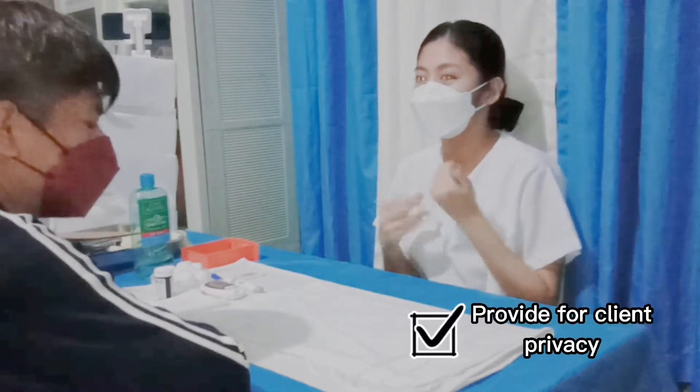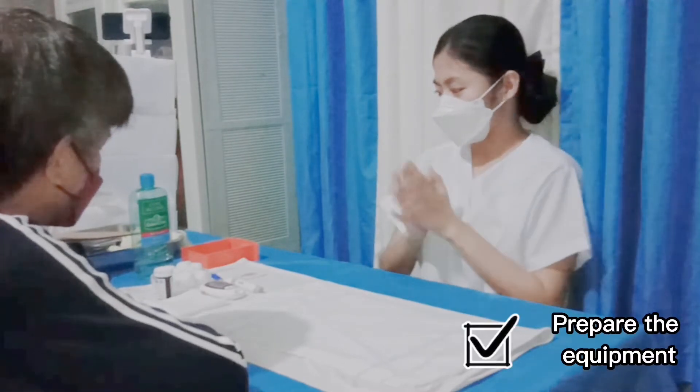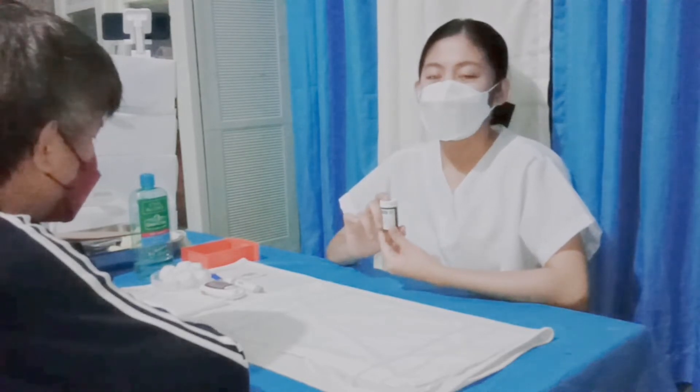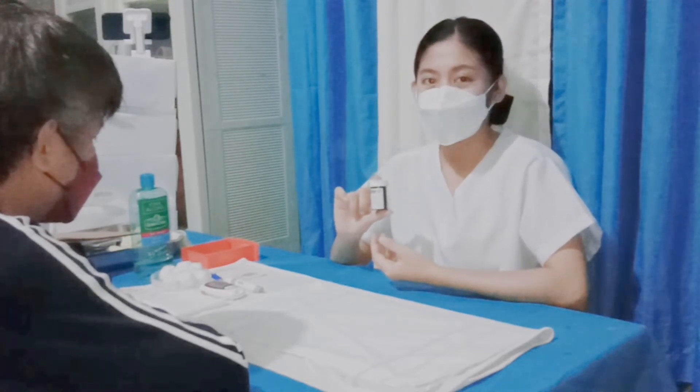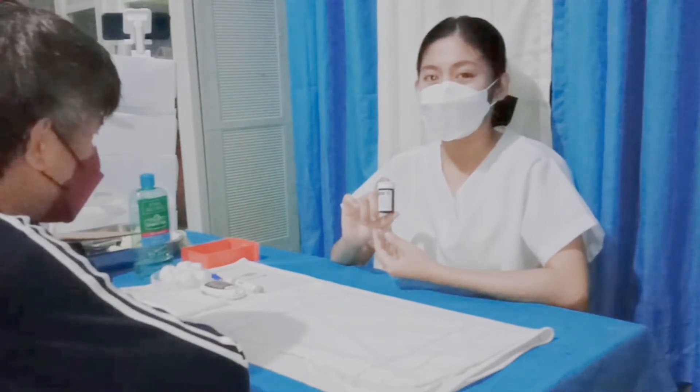Sir, I also closed all the curtains to provide you with privacy. So let me prepare the equipment first. In preparing the equipment, first I have to obtain a reagent strip and place it in a clean, dry paper towel because moisture may alter the results. Next is to calibrate the meter and run a control sample according to the manufacturer's instruction. And also, I am going to prepare the injector or the lancing device.